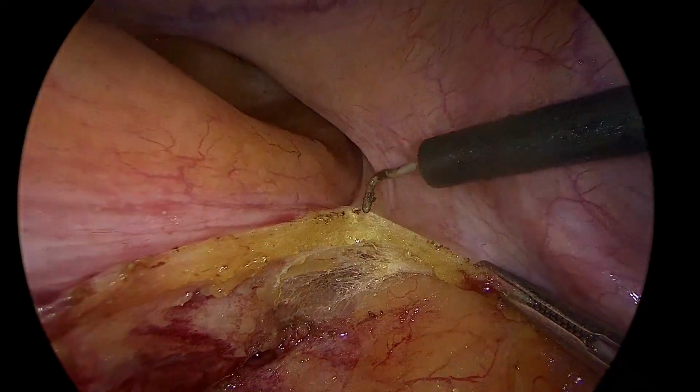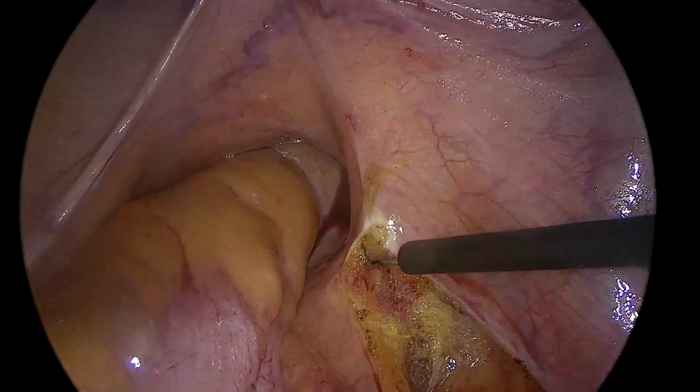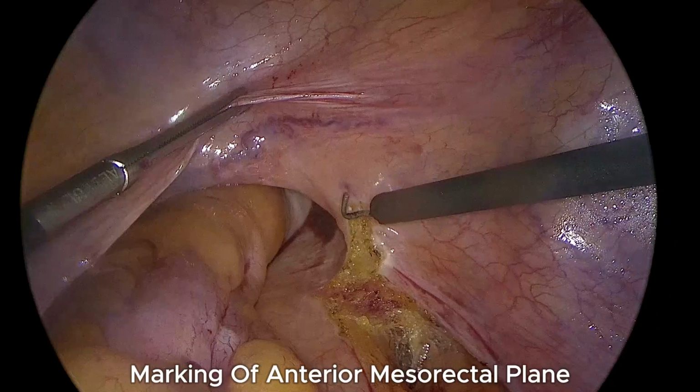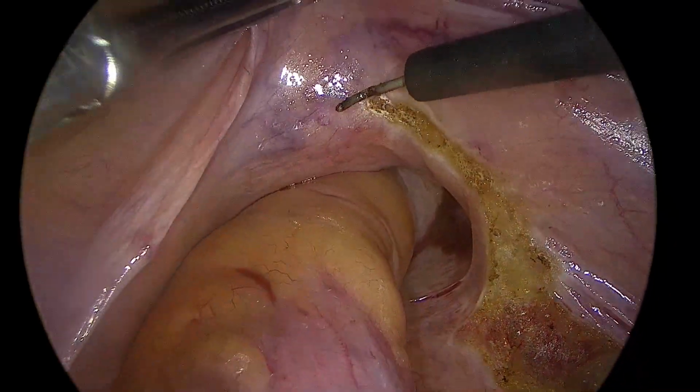First of all, we marked the anterior TME plane as it is very thin. Anterior and posterior TME dissection completed before firing of the endo-GI stapler. Complete mobilization of colon was done before that.